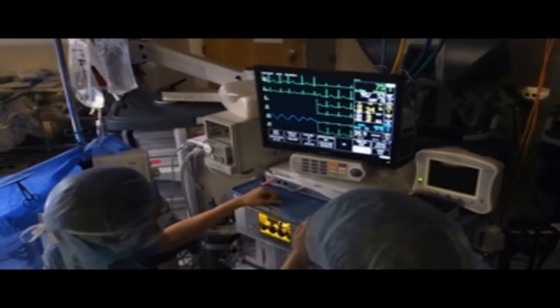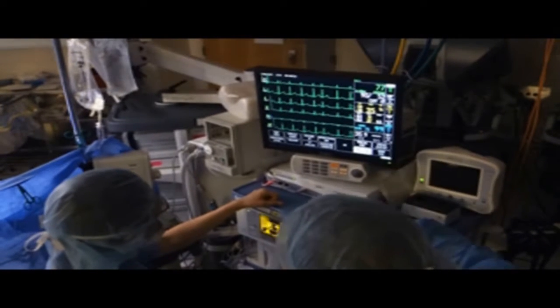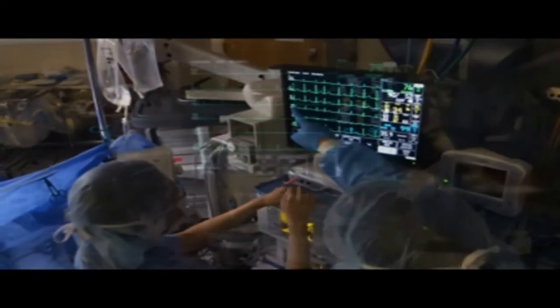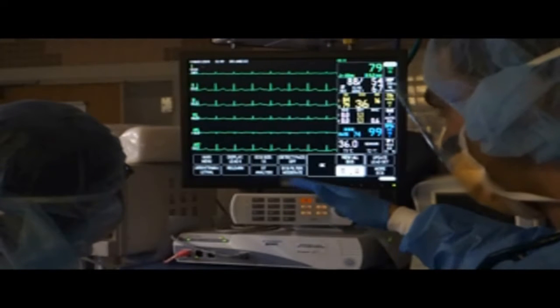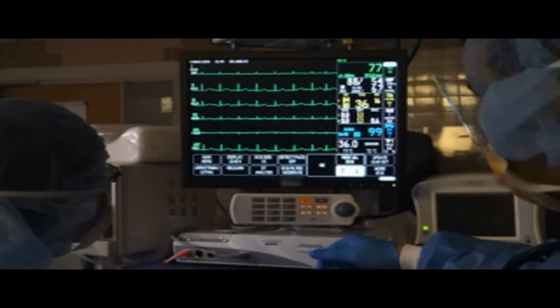However, because of the potential for undertreating or overtreating the patient on the basis of ECG data, the clinician should enlist the help of more seasoned clinicians when appropriate during recording or interpreting the ECG.